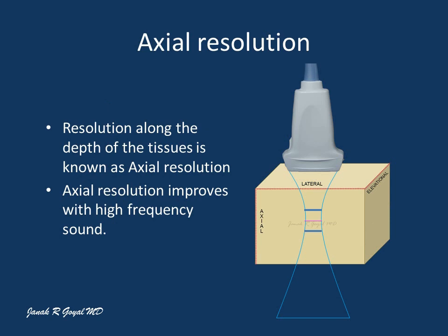Let's look into the axial resolution. Now here is your transducer and here is your sound beam. The resolution along the depth of the tissue is called the axial resolution. The axial resolution is improved by higher frequency sound.